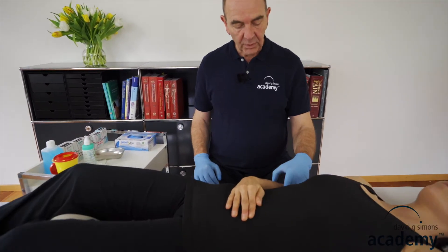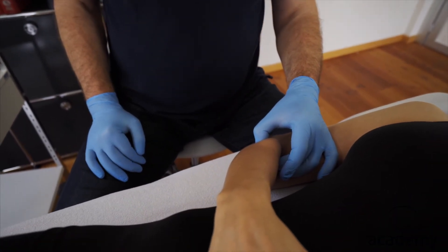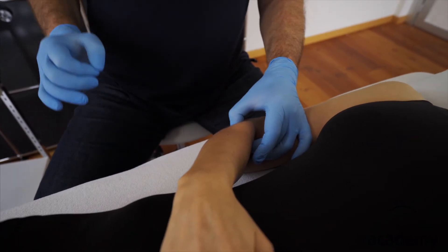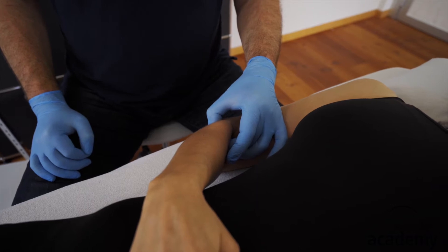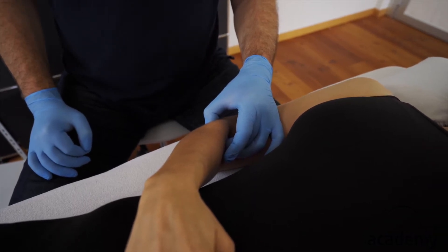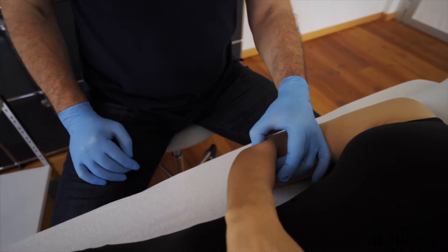Now let's have a look at the muscle. In this example I will show you the ECRL — extensor carpi radialis longus. For each muscle you check the landmarks and precautions, and decide the needle that you want to use. For the extensor carpi radialis longus I will use a three centimeter needle.